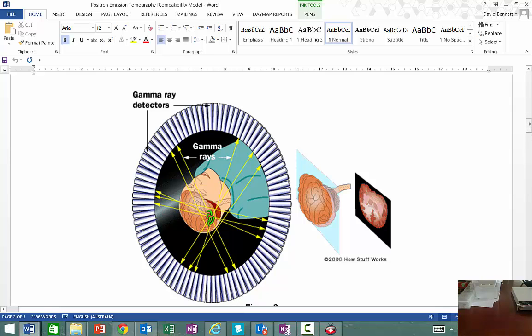And so I would think a device like this has saved certainly a huge number of lives over a fairly short period of time. What it does mean for the doctor is the doctor can operate and knows exactly where the tumour is and how big the tumour is. So therefore they can make a better diagnosis of the issue that the patient might be under duress with. Alright, so again, this is certainly a great invention and a great use of radioactive decay. So this is the application of radioactive decay with that.